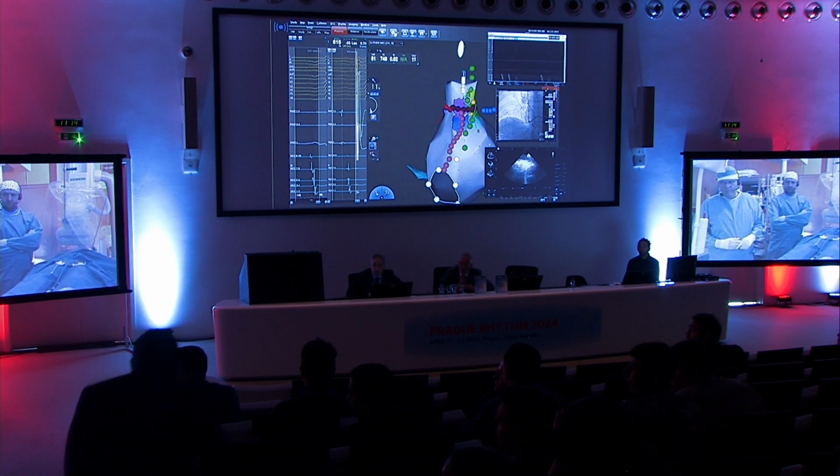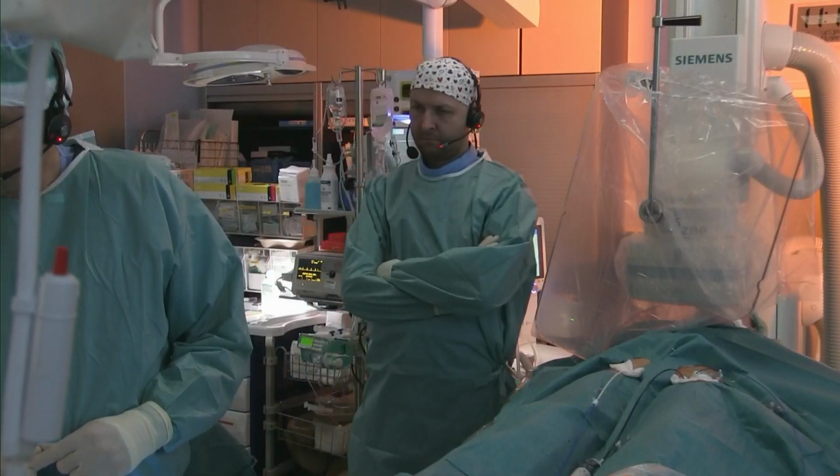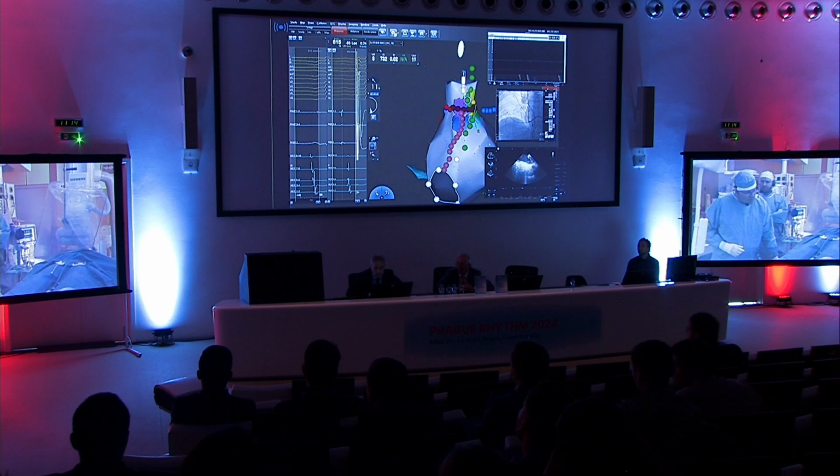Just a purely ignorant question, but you're using the Biosense catheter with the Centuri generator. Have you used it with the Biosense Webster pulse field generator as well? Do you have experience with both? No, we don't have experience with that generator. With solid tip, you mean? Or which one do you mean? Pulse field? No, we don't have.